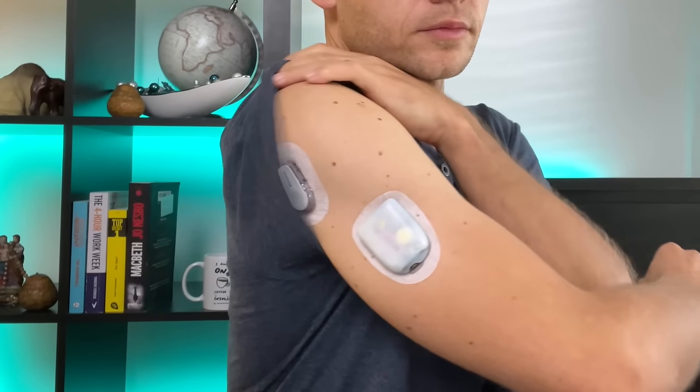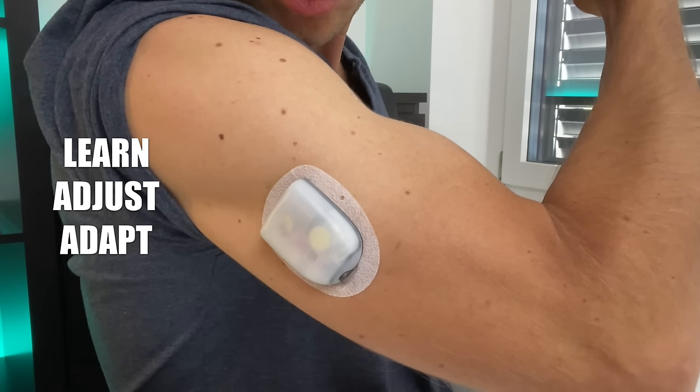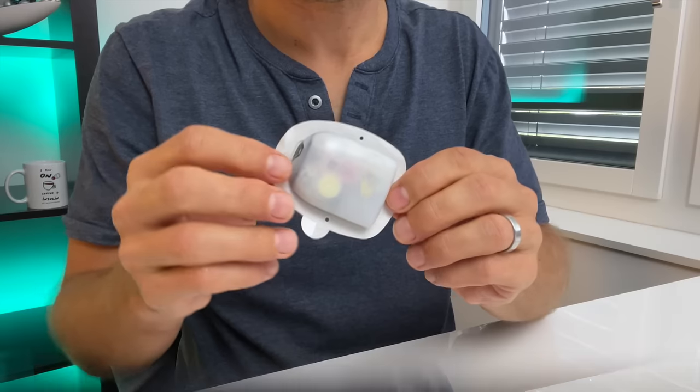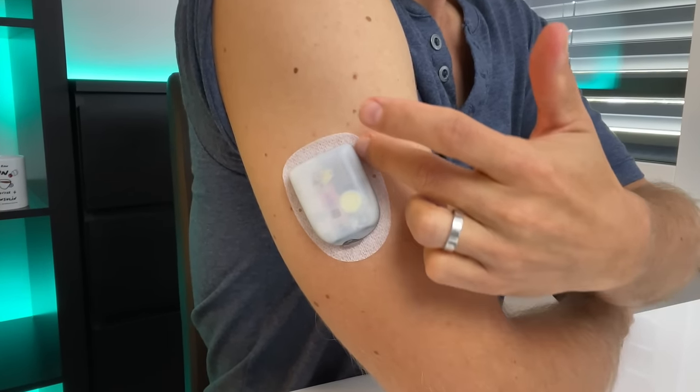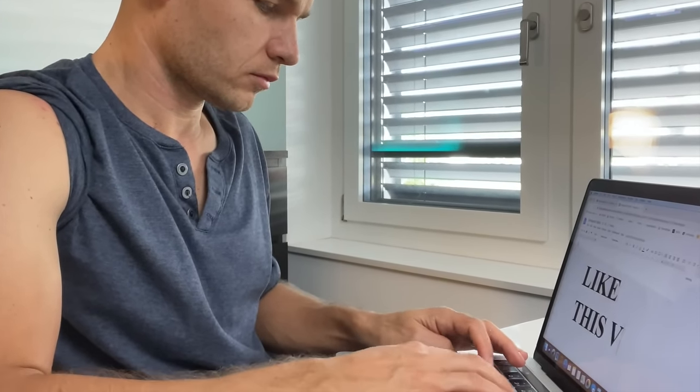Another key feature of the Omnipod 5 system is that its algorithm has the ability to learn, adjust, and adapt your insulin delivery to your current needs. As you use the system, the amount of insulin you receive every day and every hour is stored in memory and used by the algorithm to decide how much insulin to deliver in response to your CGM value in the future. In other words, the pod uses artificial intelligence and machine learning mechanisms. Each pod learns from its experience and from the experience of previous pods. So we might observe better results when it comes to time in range compared to AIDs that don't have this machine learning functionality. Patience will definitely be key, because the algorithm will need some time to learn how to best work with your body, and you will need some time to learn how to best work with the algorithm.